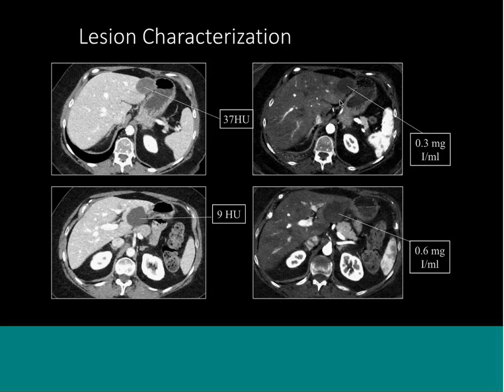If we had dual energy, in the iodine-only images you can see that they're both dark. And in fact, the iodine of this lesion is less than this lesion. We know this thing's a cyst, and the iodine is lower. If we had this at the time of our initial diagnosis, we would have spared her the anxiety from knowing that you've got a lesion in your left hepatic lobe.